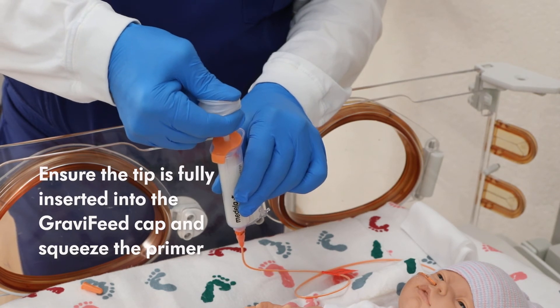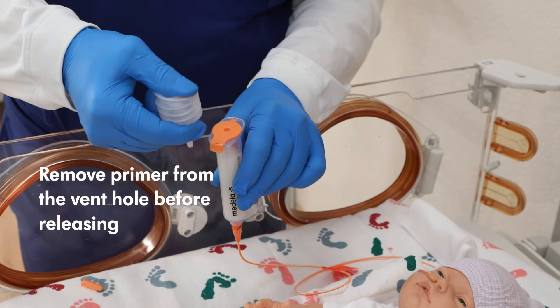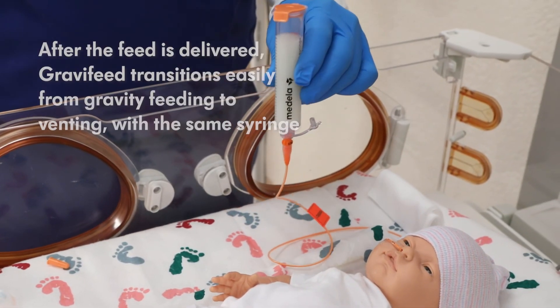It is important to remove the primer in the depressed position. Do not release until you have removed the primer from the vent hole. Hang or hold the Gravifeed vertically so the feed can continue.